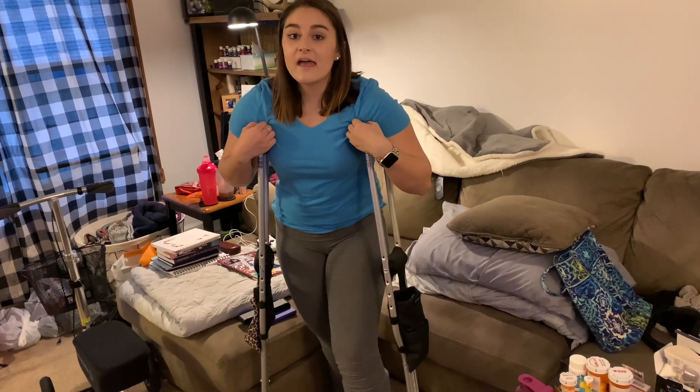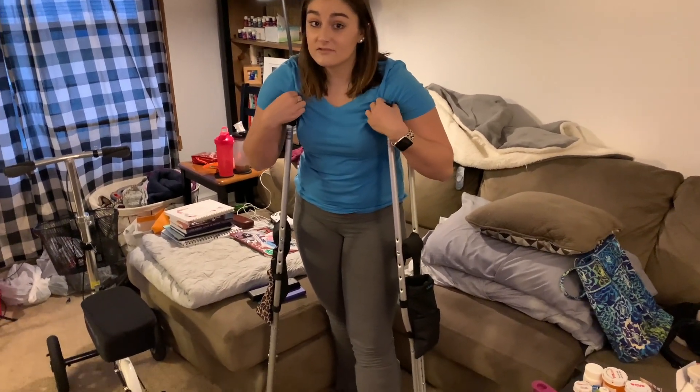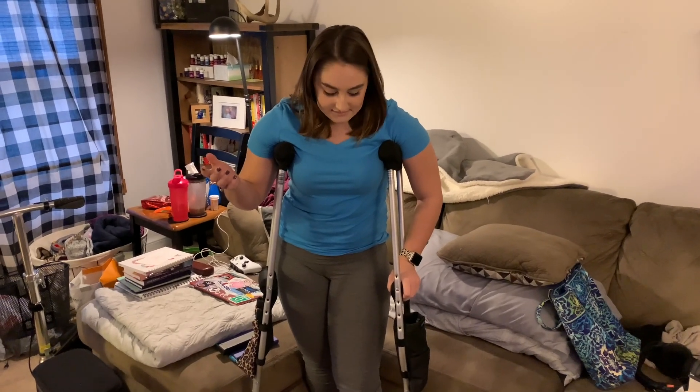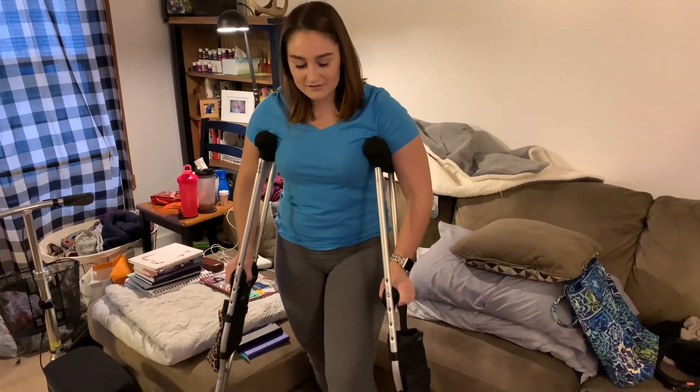First I'll show you how I get up and down the stairs. The day of my surgery I had to practice on a little platform, and then the day after surgery they made me do a full flight of stairs up and down on crutches — that was really awful but it taught me. At home I usually go down the stairs on my butt because I'm more comfortable that way and feel a lot safer, especially when I'm home alone. I do go up normally though, so I'll show you that now.